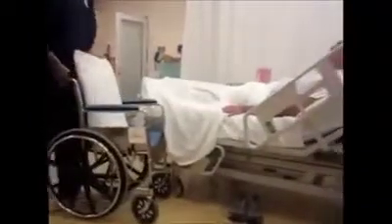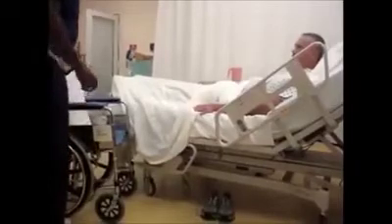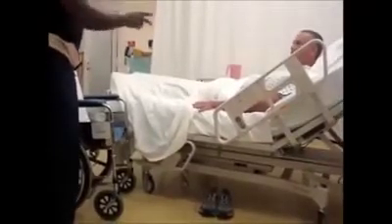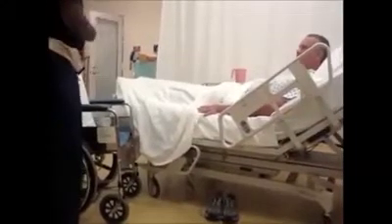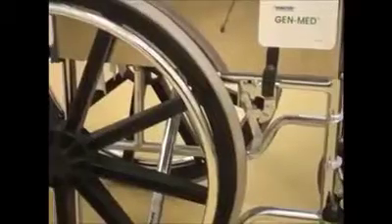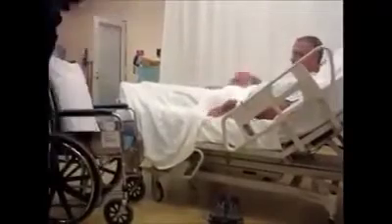Good morning, Mr. Gonzalez. Good morning. Okay, I'm Francis. I'm a nursing assistant today. You know you're supposed to have an X-ray today. Yes, sir. I'm going to transfer you from the bed to the wheelchair just to have an X-ray. That's good for you, okay? Stop. Did you check to make sure that the brakes are on? Okay, before, let me put the bed in the lowest position, please.